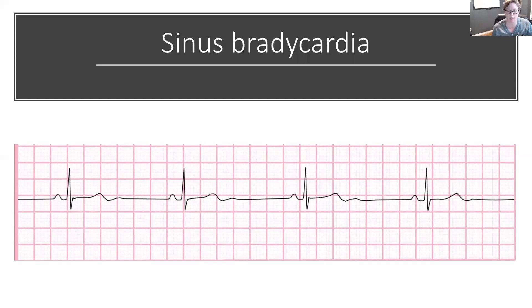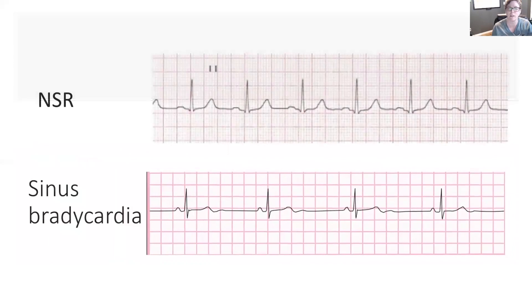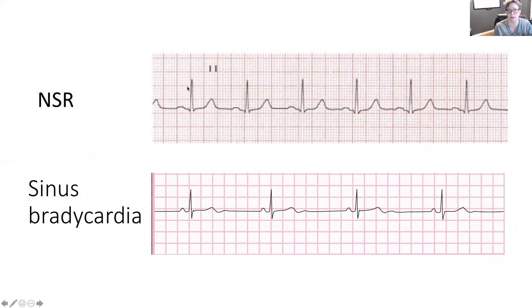Let's take a look at what a sinus bradycardic rhythm strip looks like. We can still see our P wave, QRS complex, and T wave, but there's a longer gap in between each complex. That is really the signature mark of sinus bradycardia — the ECG waveforms and intervals will be normal with the exception of rate. Comparing with normal sinus rhythm on top, we've got six R waves — a rate of 60 beats per minute. On the bottom, I only have four, so that's 40 beats per minute. Sinus bradycardia is defined as less than 60 beats per minute.